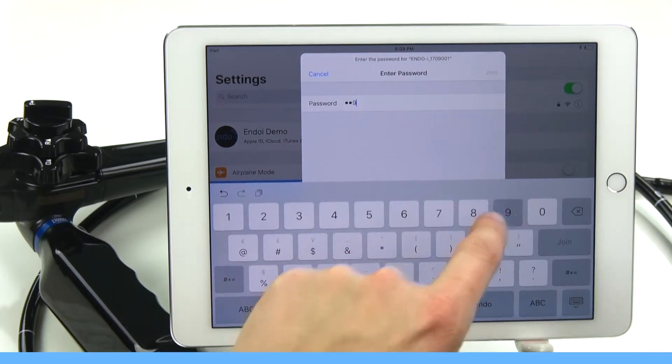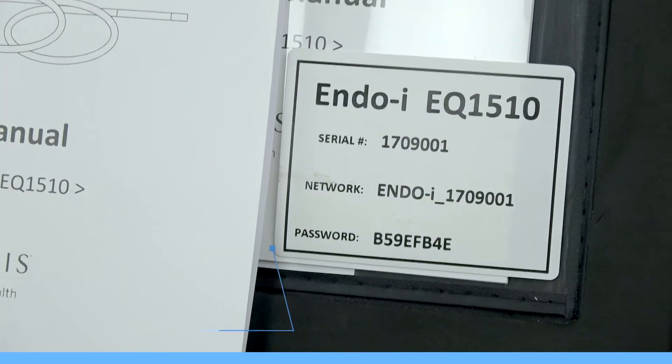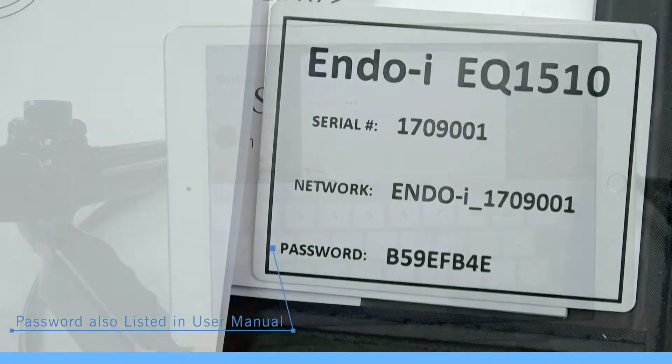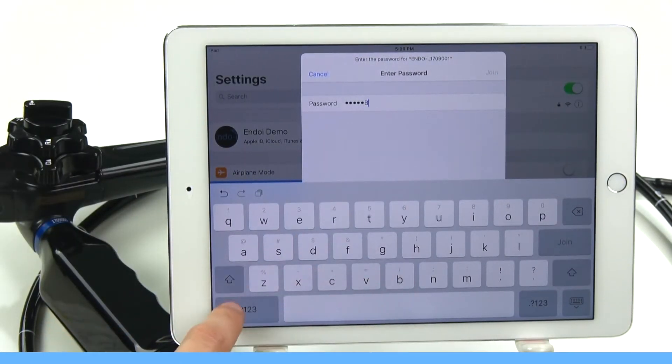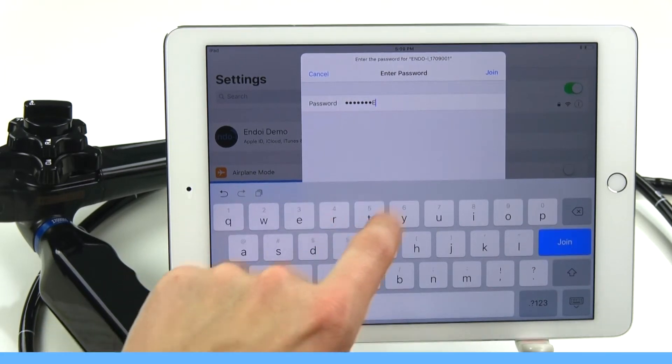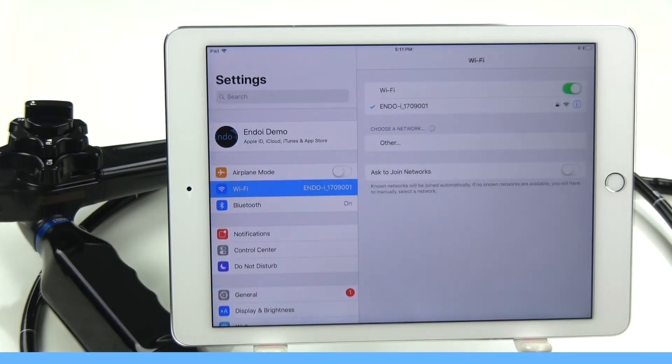Now we need to input our password. Your password can be found on the inside of your EndoI case. Each password is tied to each specific EndoI. Please note the passwords are case sensitive. We'll see that the scope and the tablet are now connected.